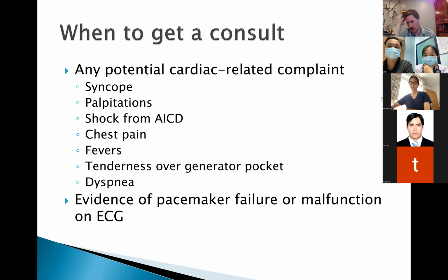So, recommendations on when to get a consult in patients with pacemakers. I would get a consult if the patient is complaining of any of these symptoms. Syncope is a really major complaint that would always inform me to get a cardiology consult and get this pacemaker interrogated, because it could be a sign that the patient is having issues with failure to capture, maybe there's pacemaker syndrome going on, maybe they're having a ventricular tachycardia that is occurring sporadically. And all these answers can be obtained with an EKG, a cardiology consult, and then having the pacemaker interrogated.